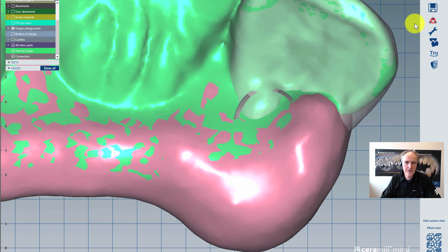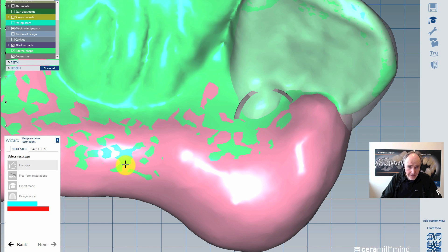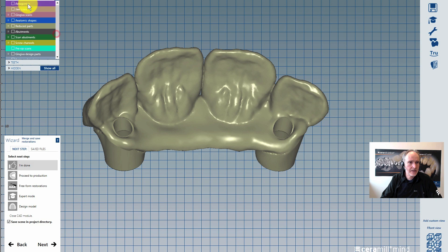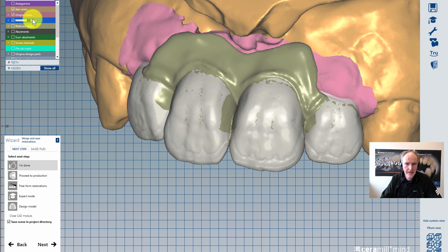And finally now with the wizard it will complete with the anatomic shape. Now you can see nicely here our Knut cutback teeth. All that gray material would be restored with ceramic.